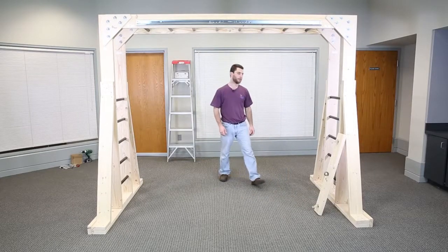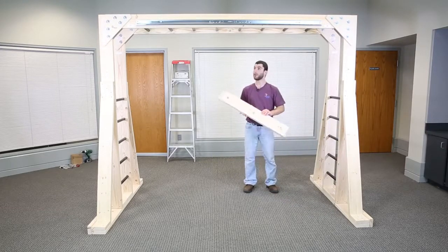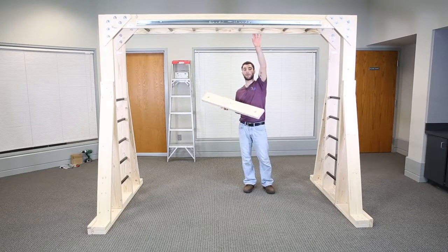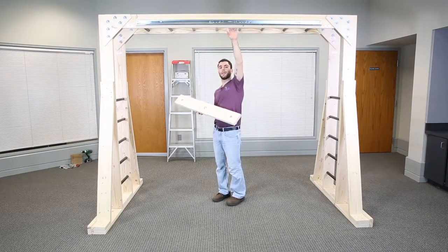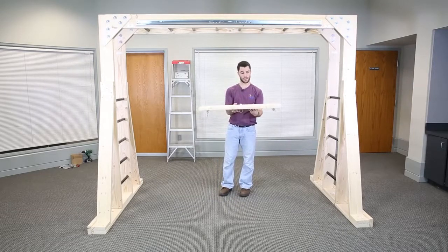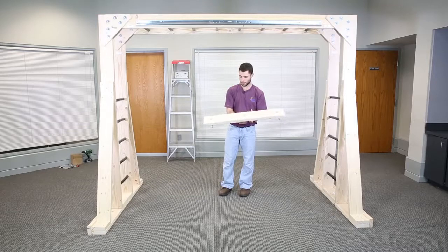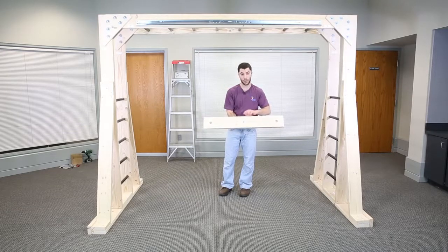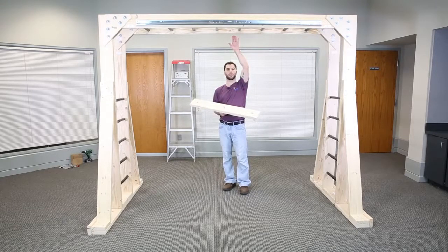Another of our attachments is the swing board. The swing board goes on top of the overhead monkey bars, in the center, which is indicated by a label on the inside of the overhead monkey bars. On the top, this will be the top of the swing board with the hangers and bolts facing downward. On the top of the swing board are 4 pre-drilled holes. They will line up with pre-drilled holes on top of the overhead monkey bars.